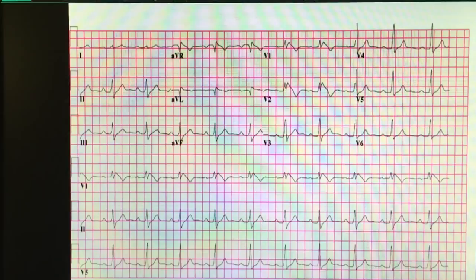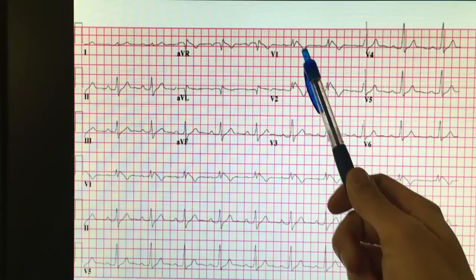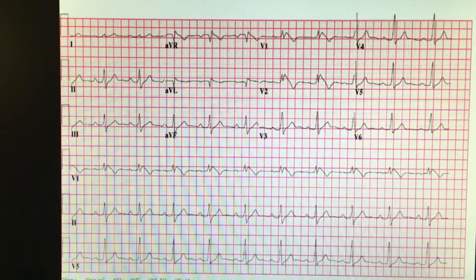Here's another one. A person comes in with syncope. Looking at V1, V2, V3 — you see that little pattern there? It looks almost like a yin-yang type sign. That's a Brugada-looking EKG. Those are type 1.